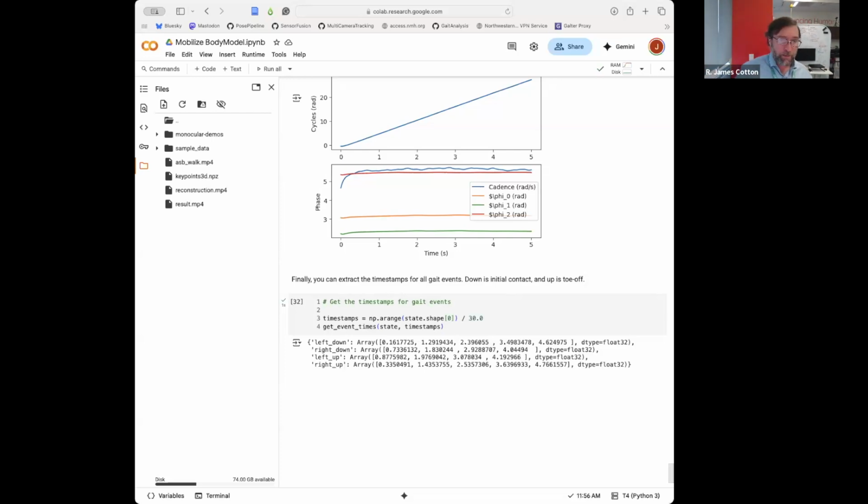We have some early pilot data, prototyping code that gets rid of calibration. There are algorithms now that use structure from motion that can look at the multi-view geometry and reconstruct the entire 3D geometry, including the camera positions. Those give us nice initial conditions, and because we can optimize the extrinsics during the calibration process, I think we'll get there. It's definitely on the roadmap. I'm coupling a couple of things, including the multi-person association with that. So it's a bigger project.